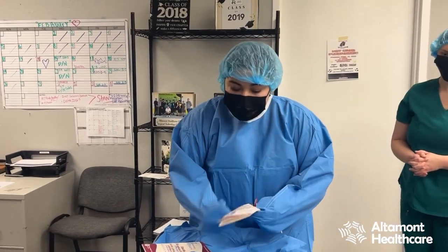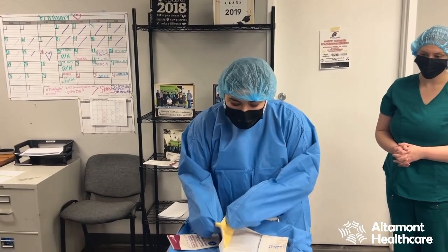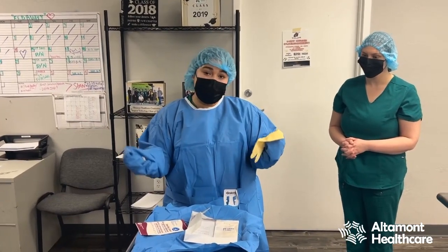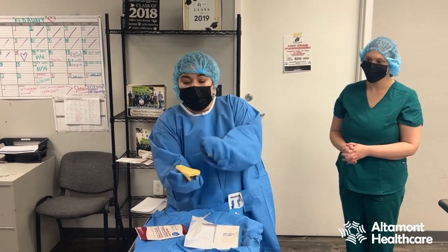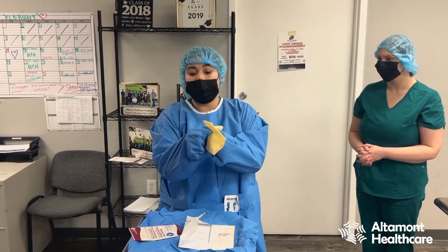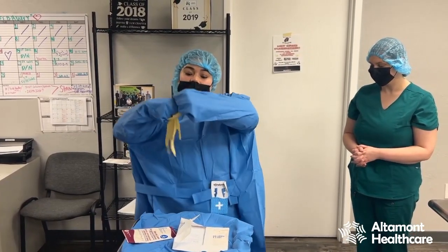I'm going to start off with the larger size gloves, which in my case is 7.5. You always want to start with the right — unless you're left-handed, the right glove is always best to start with. I'm going to place my glove with all the fingers pointed towards me. With my bottom hand I'll grasp one end, with my top hand the other, and flip it over.